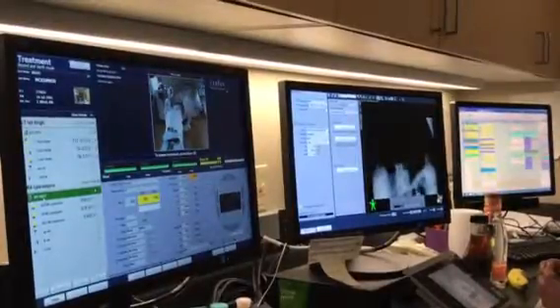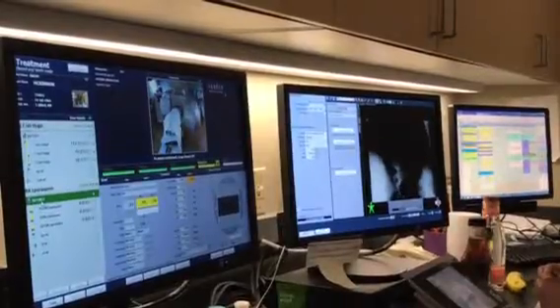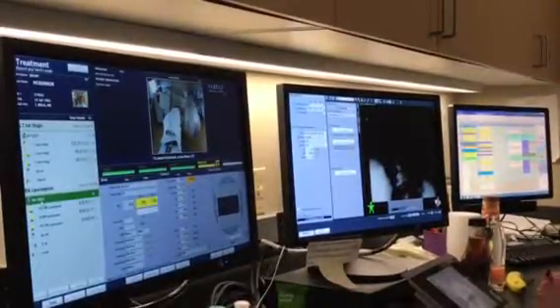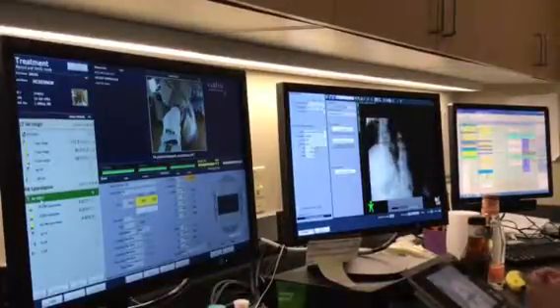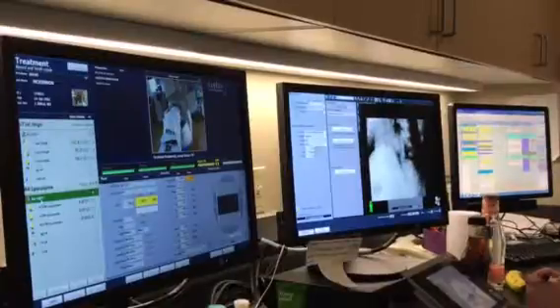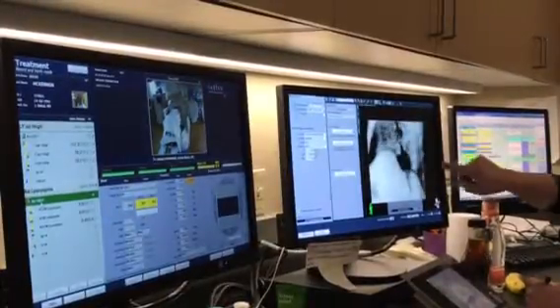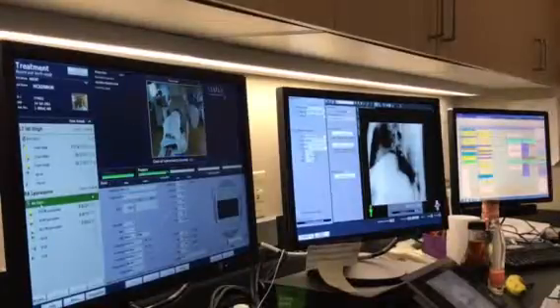Can you talk me through the spine one since I've not seen this one yet? Sure. This is the one that worries me. Can you see how you can see him breathing? You see his lungs a little bit. So this is a real time cone beam.